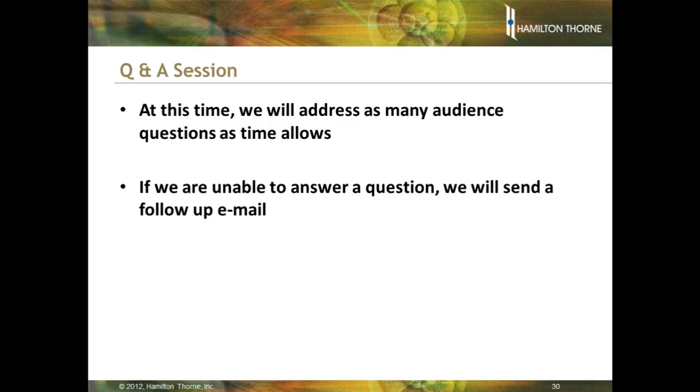Sure. Dr. Behr, here's an interesting question. How would you troubleshoot when a blastocyst collapses during the biopsy? Yes, that's a very good question, and it is quite common that when the blastocele is breached by the first fire of the laser, the blastocele may indeed collapse. And this is important relative to the trough or the hatch hole that is made on day 3. It is for that reason that I prefer a trough or make a very, very small hole so that you can create some tension.